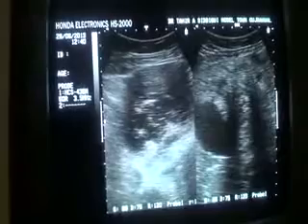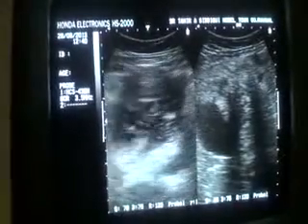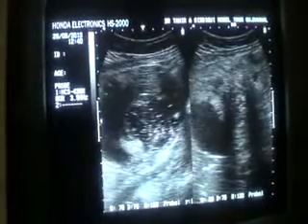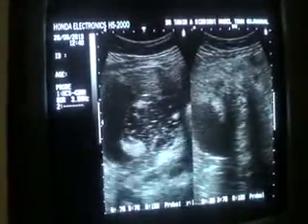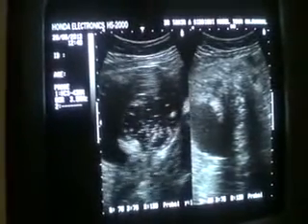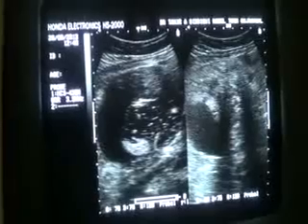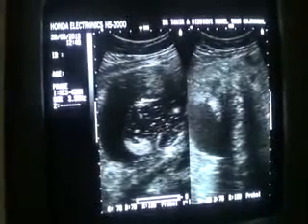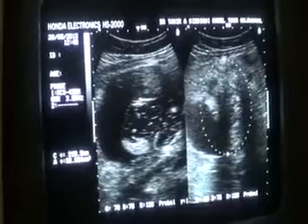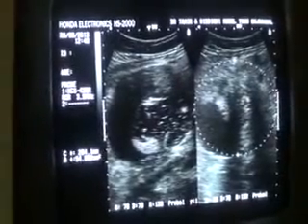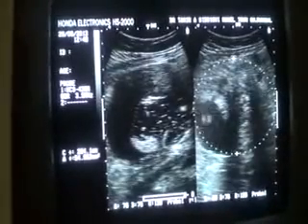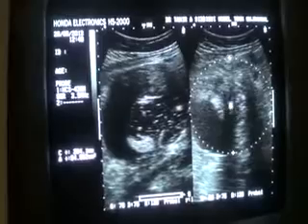Here we are again. And there are other findings — when I move downwards, there are dense echogenic areas, because in the dependent region of the cyst. Now I see that this is the cyst in the region of the left adnexa. These are echogenic lines with no posterior shadowing. This is the fluid part within this cyst. And this is the echogenic area giving posterior shadowing.